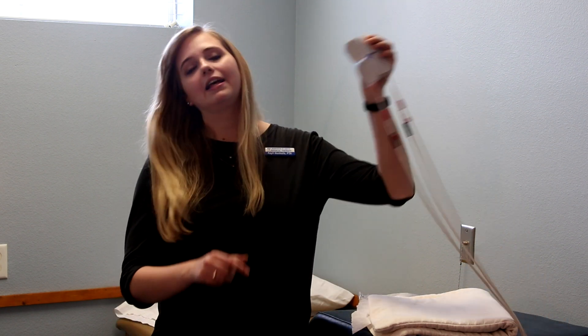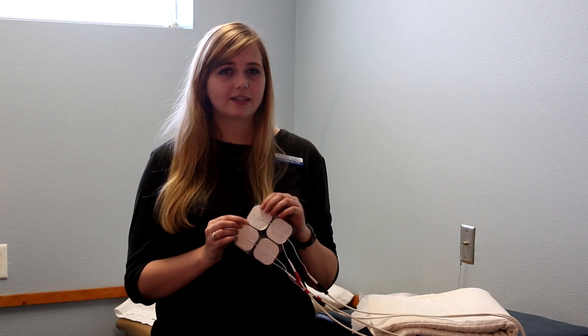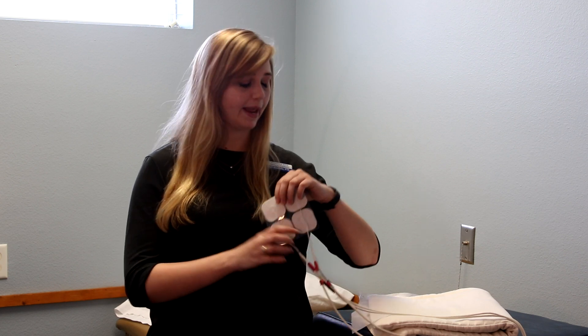Often, we will pair it with electrical stimulation or e-stim. We place four electrodes around the area that hurts and they send a gentle electrical impulse through your body that's going to help decrease pain.